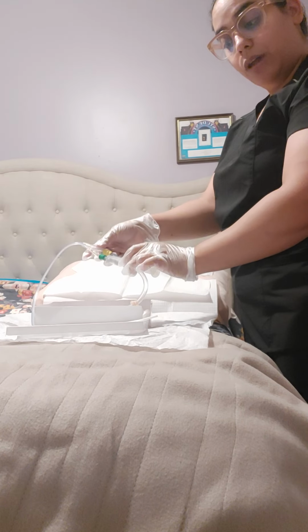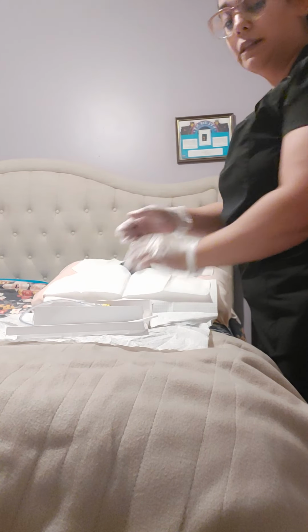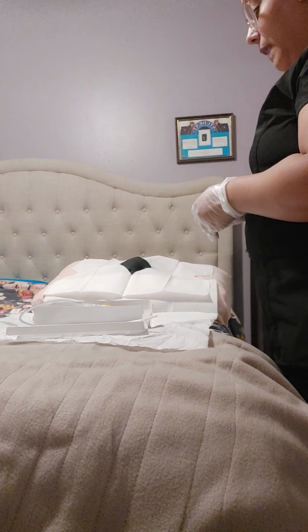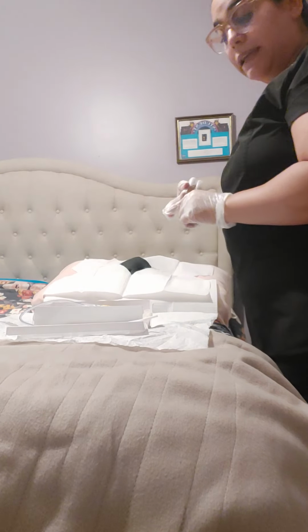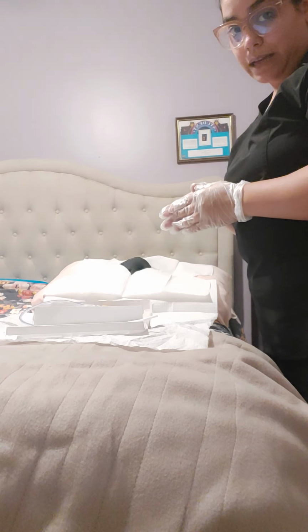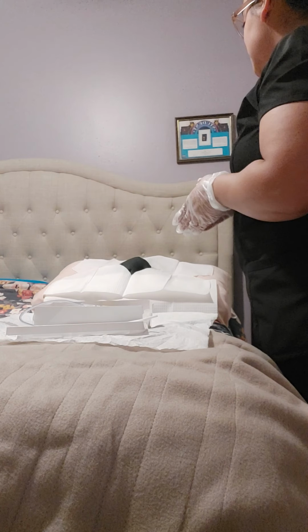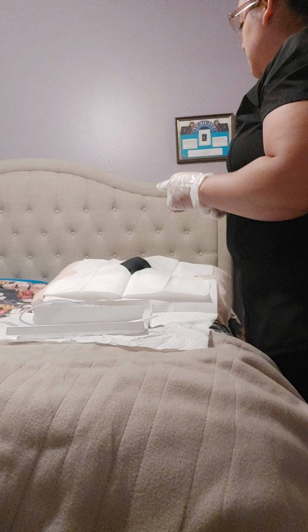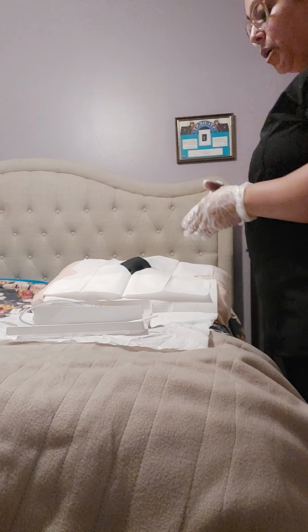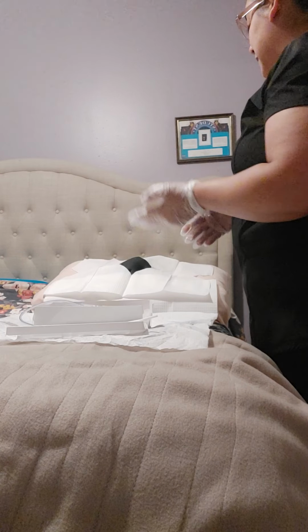So now that I have all of this ready, I'm going to clean the patient and prepare the patient. And I will also ask the patient if they have any allergies to iodine or to latex because I am using latex gloves and because we are using betadine. Do you have any allergies, and specifically to shellfish, iodine, or latex? No? Okay, perfect.